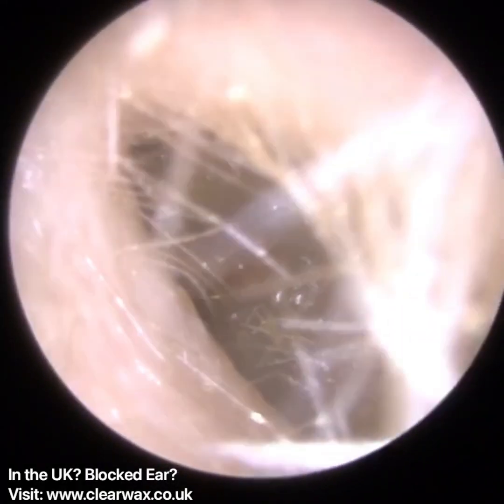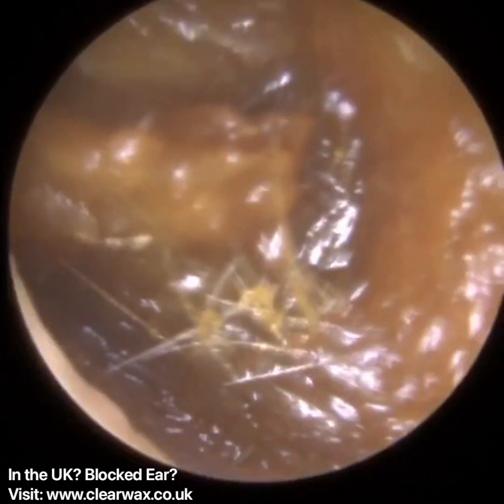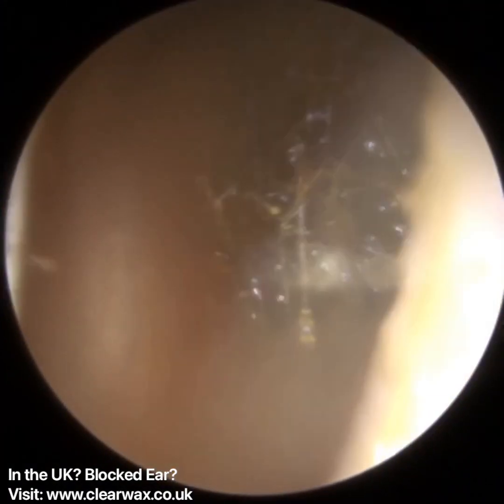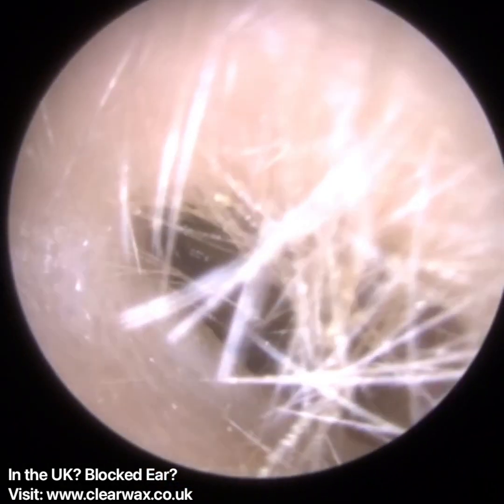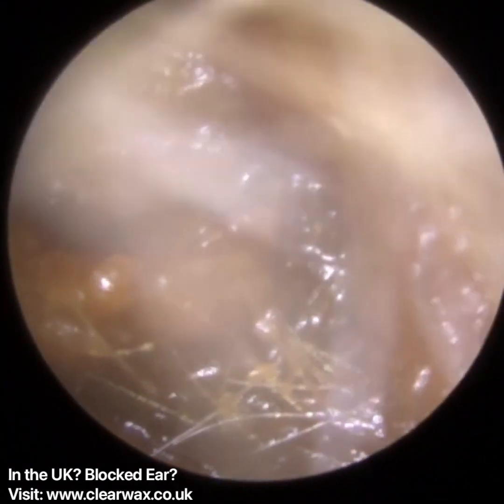This is of a patient who attended a couple of weeks ago and they were referred by a colleague, another audiologist based in Leicester. Unfortunately, they struggled to remove the wax in this case, in part because the mid-canal, so halfway down the ear canal, there was a bit of a narrowing in both ears, but also because the wax was really medially impacted, it was really deep.